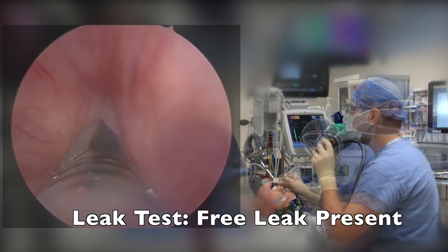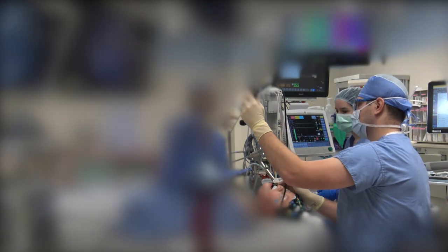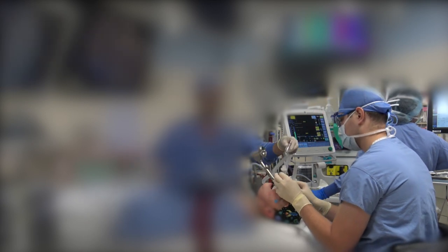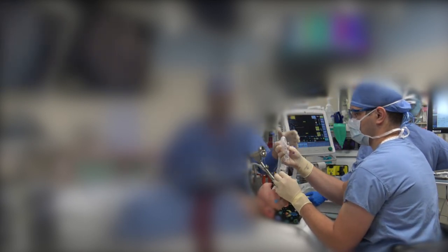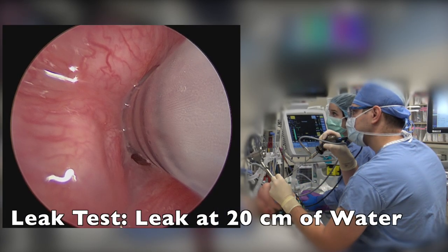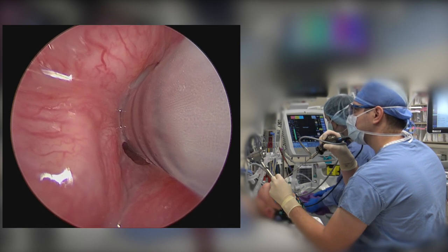We then ask the anesthesia colleagues to increase the positive pressure starting at zero and increasing until 30 centimeters water pressure is reached in order to test for an air leak around the endotracheal tube. Normal leak would occur between 10 to 20 centimeters water pressure, which would indicate an appropriately sized endotracheal tube. We can consult a chart to see if there is any evidence of subglottic stenosis.